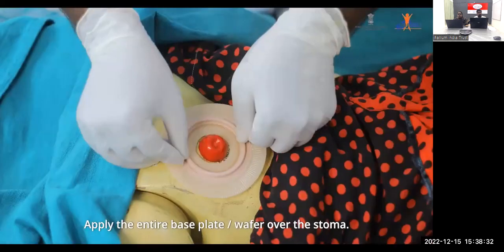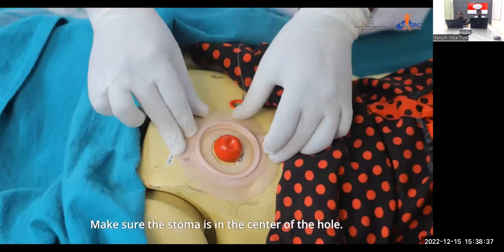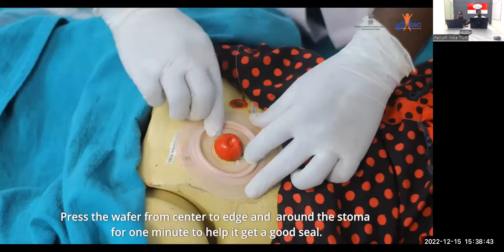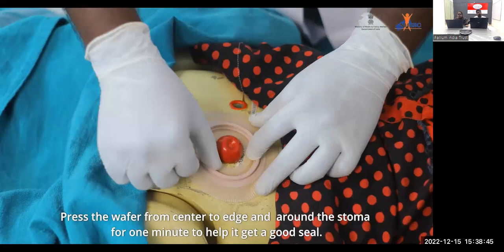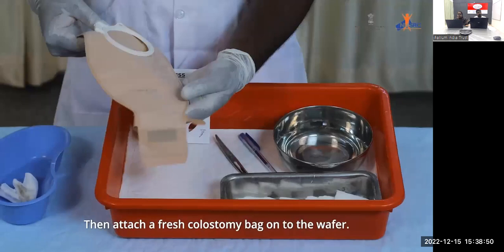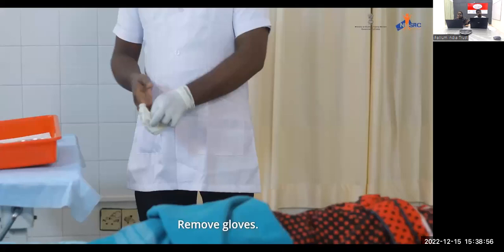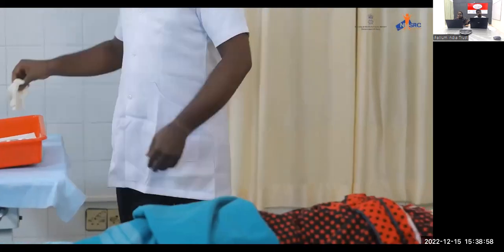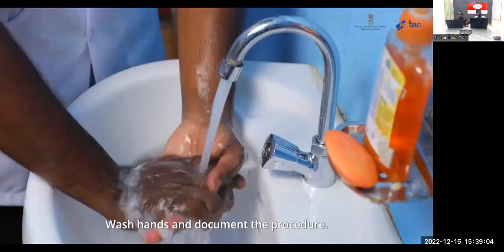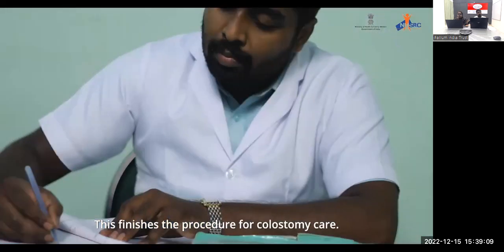Apply the entire base plate or wafer over the stoma. Make sure the stoma is in the center of the hole. Press the wafer from the center to the edge and around the stoma for 1 minute to help it get a good seal. Then attach a fresh colostomy bag onto the wafer. Remove gloves. Ensure the patient is comfortable. Wash hands and document the procedure. This finishes the procedure for colostomy care.